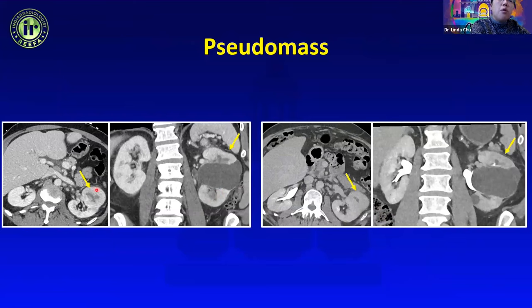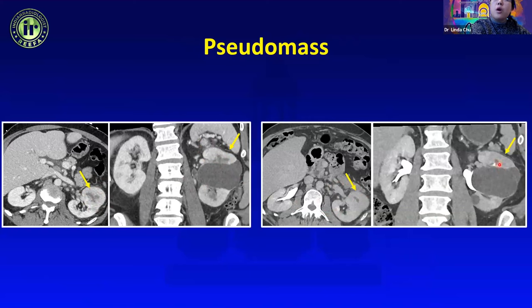3D images also help distinguish real masses from pseudomasses. This patient was referred for renal mass biopsy — on the axials it looks like a heterogeneously enhancing mass, but on the coronal you get the impression the central hypodense area is unopacified renal calyces, distorted by a large renal cyst. Instead of biopsy, I recommended delayed phase imaging, which confirmed contrast opacification of the calyces — this was normal renal parenchyma, not a renal mass.